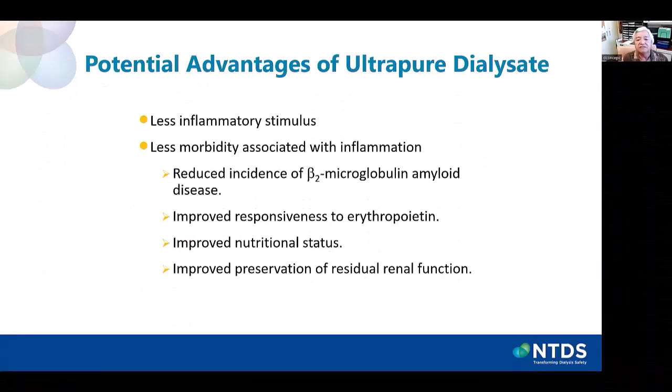And these are the potential advantages of ultrapure dialysate. There's less inflammatory stimulus, less morbidity associated with inflammation, reduced incidence of beta 2 microglobulin amyloid disease, improved responsiveness to erythropoietin, improved nutritional status, and improved preservation of residual renal function.